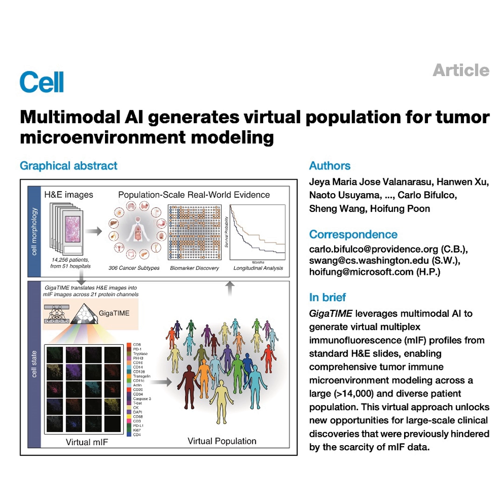And that's looking at what? Instead of pixels, it looks at little 8x8 windows, about the size of one cell. It's checking if the AI correctly counted and localized the active cells in that little neighborhood. So it's not just about the shape, but about getting the right cells in the right places.